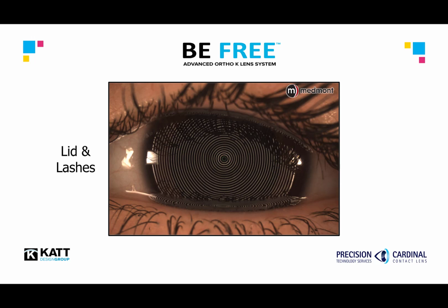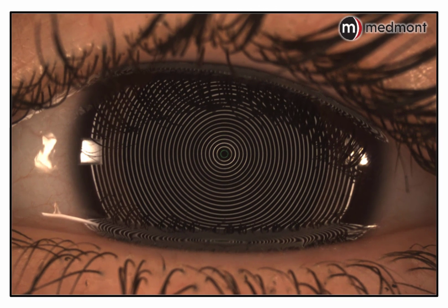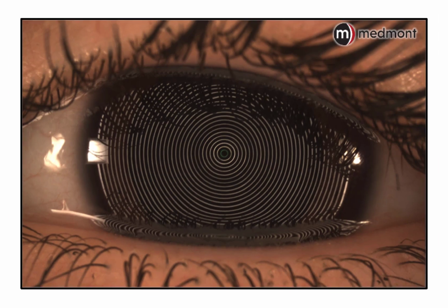When capturing the corneal topography, ask your patient to open up as wide as possible, and that will limit the lid and lash interference that may block the rings from getting access to reflecting off the corneal surface. The more corneal coverage that you can achieve, the more accurate your initial lens is likely to be.